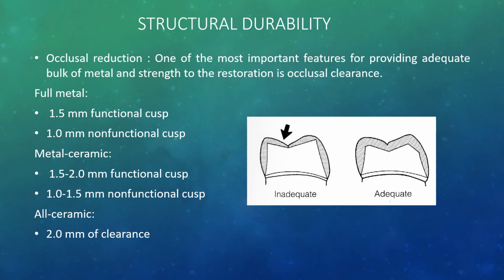And if you are unable to make a choice like that, the only way of doing it is that you need to understand that the diameter of the burr itself is in such a way that it provides a 2 mm clearance.